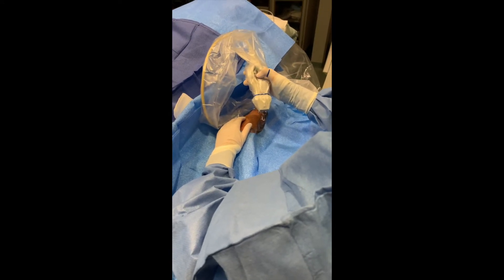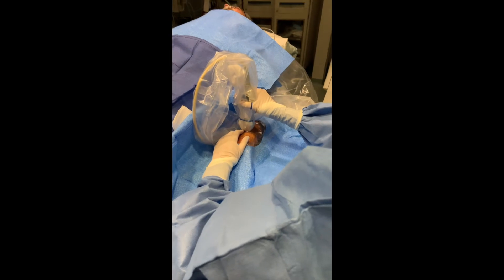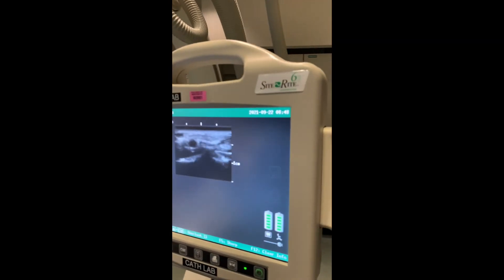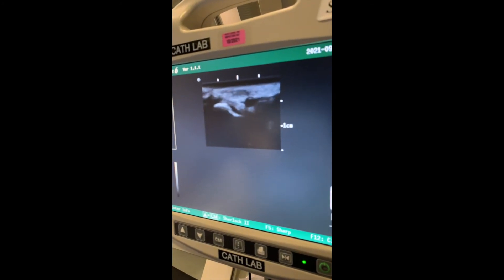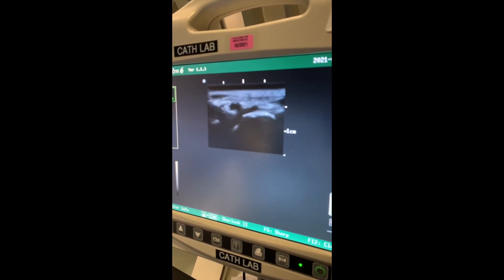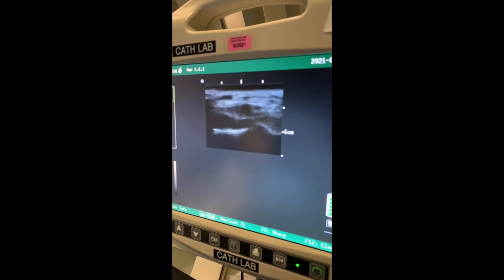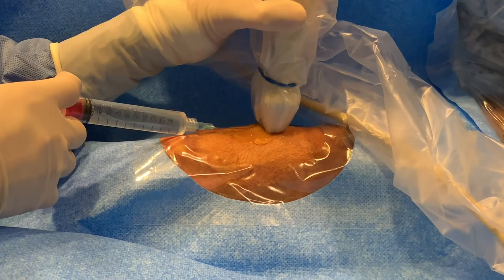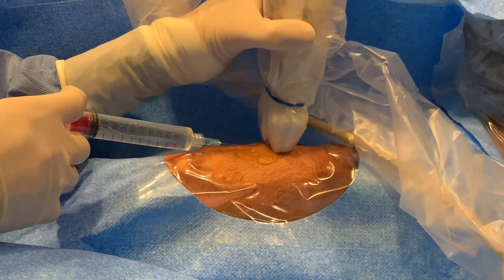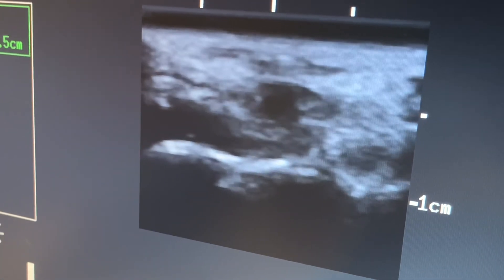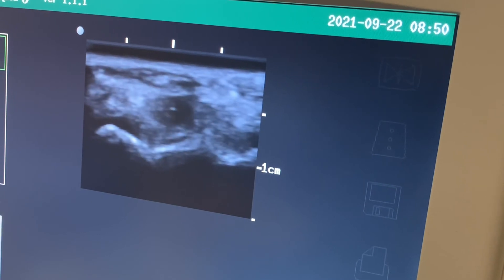Ultrasound should be utilized for every distal radial artery access. There is the vessel — quite clear to see. A modest amount of lidocaine is all that is required, and you can use the ultrasound to guide your local infiltration.